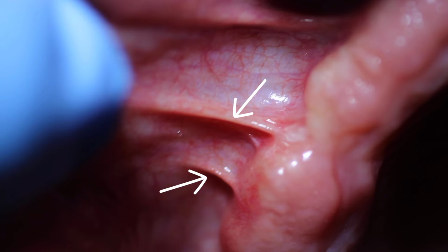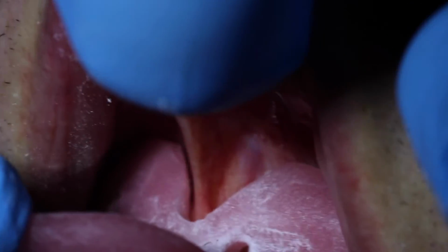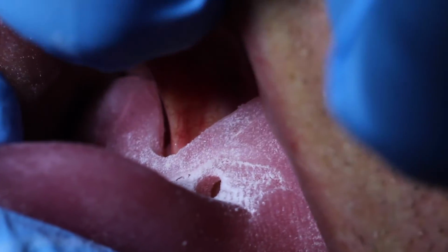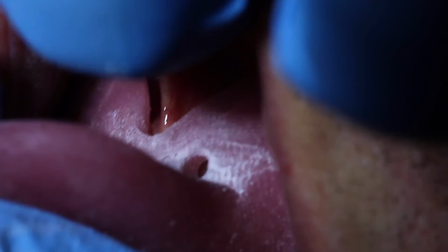So that's what those frenums look like without the custom tray. Sometimes it helps just to remove the tray, go back and put your tray back on and make sure it's adjusted properly. All right, so now you can see that the tray here in the front is not impinging on that frenum, so that they can freely move, and it's not going to displace the tray, which means it won't displace the denture, which means your denture won't fall out. All right, so that one's good.